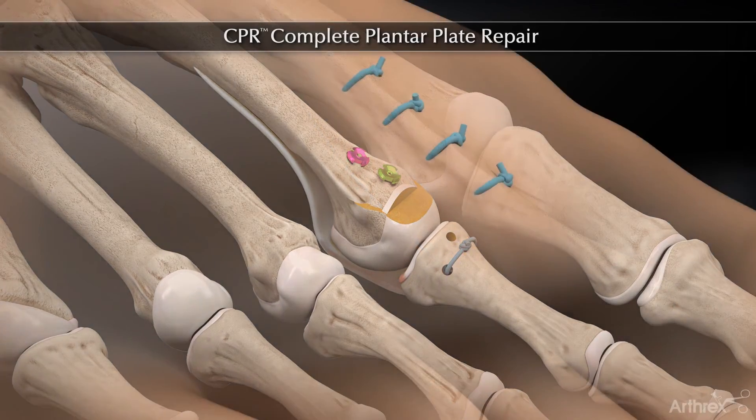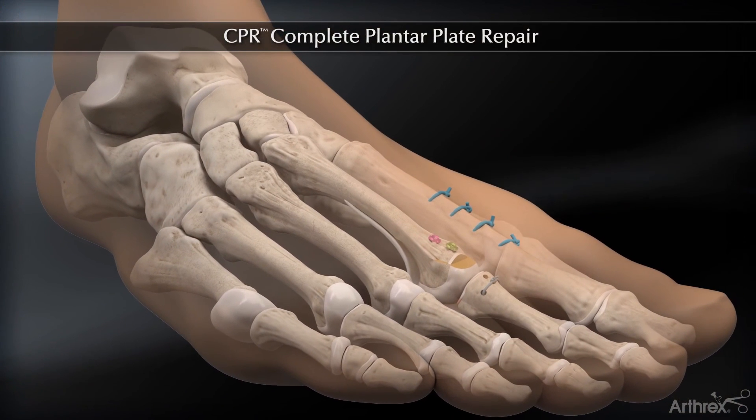The suture is then tied over the bony bridge, finishing the repair of the plantar plate.